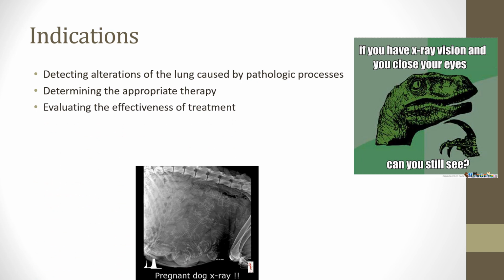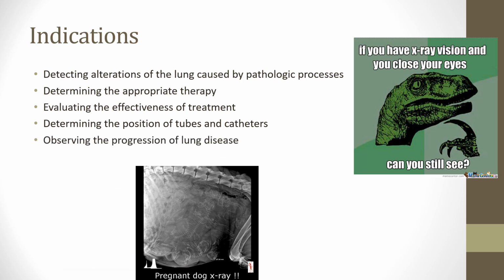How effective is that treatment? 24 hours later, get a repeat x-ray. Let's see what's going on with that patient. Tubes and catheters, especially endotracheal tube, chest tubes, OG-NGs, central lines, all those things are going to be very, very helpful. So if someone puts in a central line, is that an indication for a chest x-ray? Yeah, line placement, right? Same thing, intubation, line placement, sort of, right? ET tube placement, right? So that's one of the things that we want to look at here.